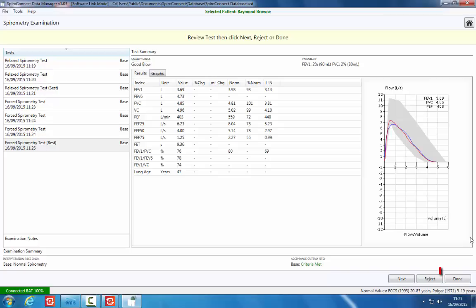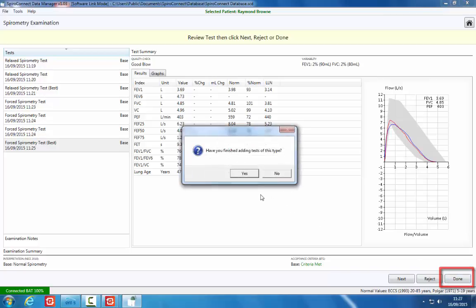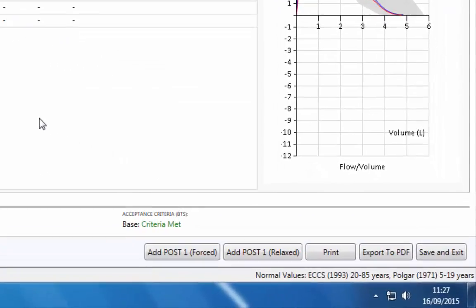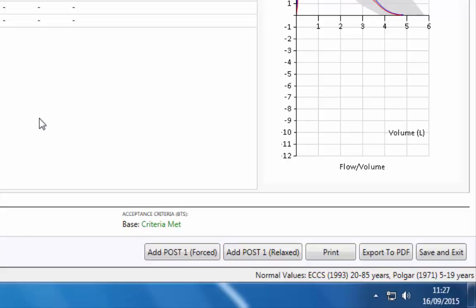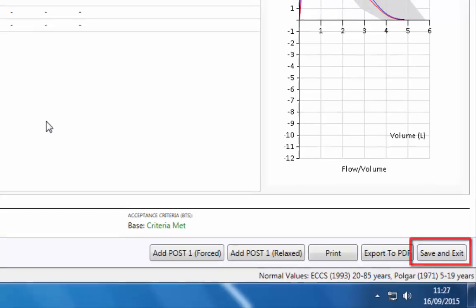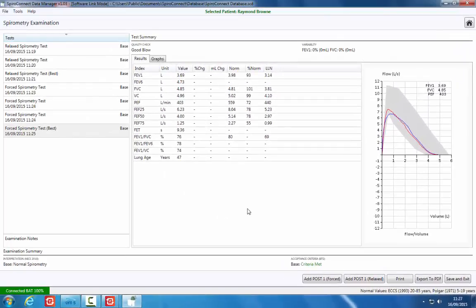When sufficient forced blows have been completed, click the Done button. If immediately performing post-bronchodilator forced tests, click the Add Post 1 Forced button and proceed with the post tests in the same way as the baseline tests. If you are not performing post-bronchodilator forced tests, or you are performing these after seeing another patient, click the Save and Exit button to return to the home screen, then exit the software.